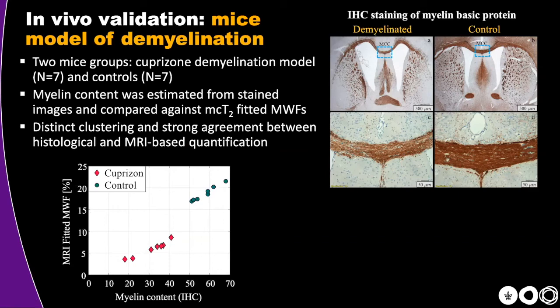The problem is when you move to a different scanner, or if you want to change your parameter values and compare your data to data that you acquired 2 years ago with a different echo time, and then you get different values. And this is not something that you would want. You would want to be able to compare the values that you're measuring with values that you measured in the past, before the scanner had a software upgrade.